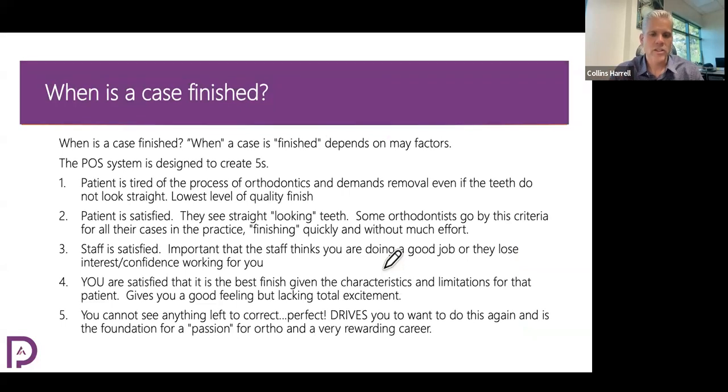When is a case finished? Okay. A case is finished when any one of these 5 things is happening, and we'll go through those real quick, but we're trying to design a system that creates 5s, this category down here. Okay. So the first one is the case is finished because the patient is tired of the process and they want to be done. And the teeth look straight enough to them. You can tell that they're not perfectly straight, but the patient's happy and they're wanting to be done. So that's the lowest level of quality finish.